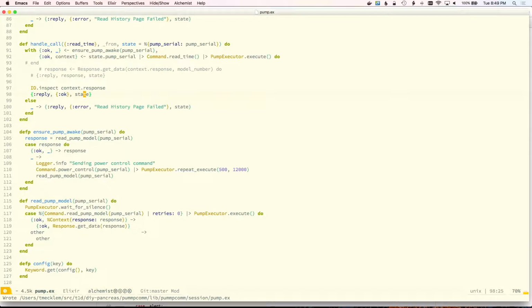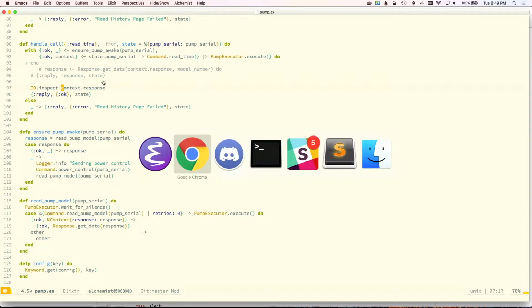So really this state stays the same for almost all the GenServer calls. I'm not sure if the GenServer is really the right way to go with this, but I'm kind of going with it for the moment. So let's just see what happens if we call read time on this thing.